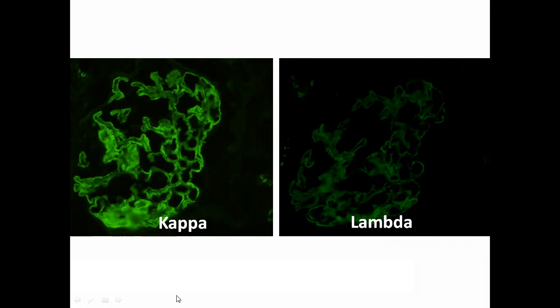If you find an occasional lymphocyte here and there, then you can ignore it, because that could be in the circulation also. This is just a lymphocyte that has come. So if the capillary lumen is full of inflammatory cells, or even if the cells are fewer but the endothelial lining is reacting to them, then you consider that endocapillary hypercellularity. There is no number, like it has to be 2 cells or 3 or 4 cells. It is just that whatever cell is there should be reacting to the endothelial lining. Okay, so kappa is positive, lambda is negative.